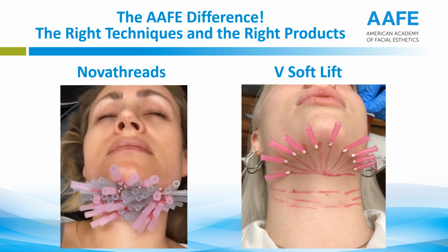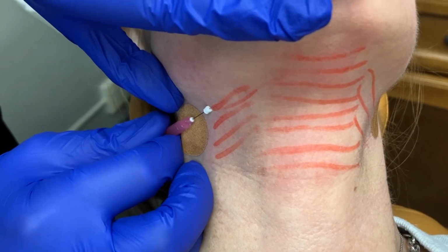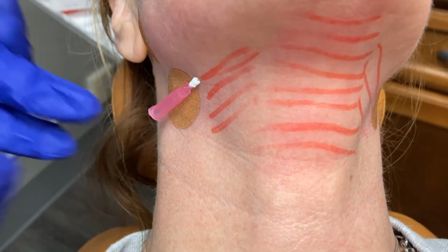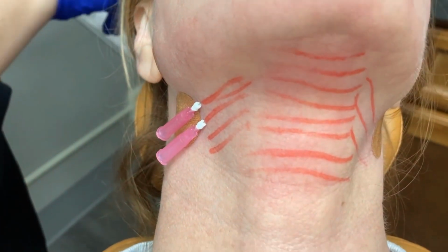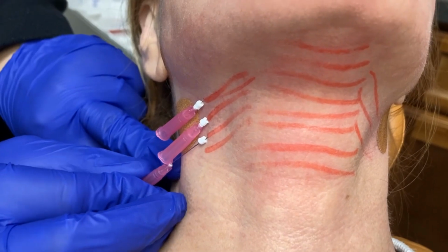We're going to show you on that same patient from before how to do a little bit of neck tightening here with smooth PDO threads. Then we'll show you her complete before and after. So here we go. Here is a great use of solid filler smooth PDO threads in the neck, for necklace lines, for tightening that neck and chin, and permanently removing the fat underneath the chin. But let's start with this. Smooth PDO threads. What happens?